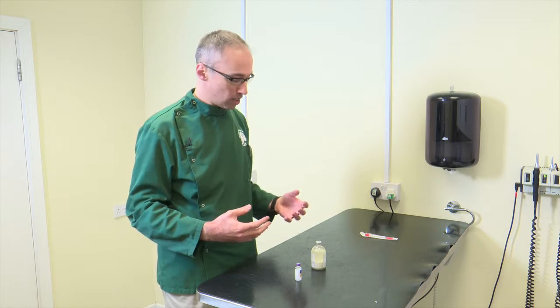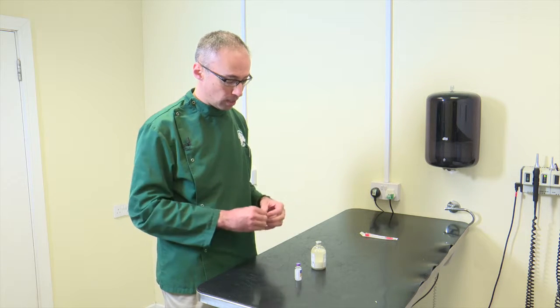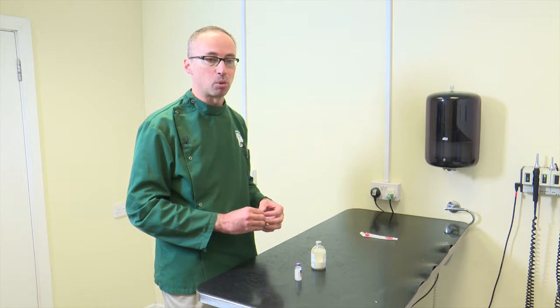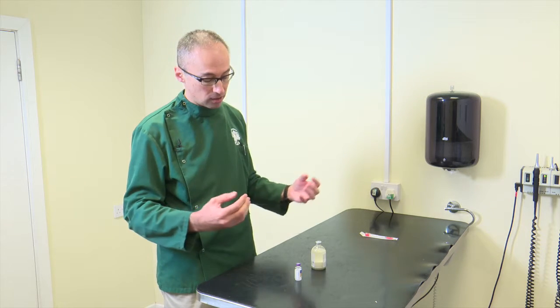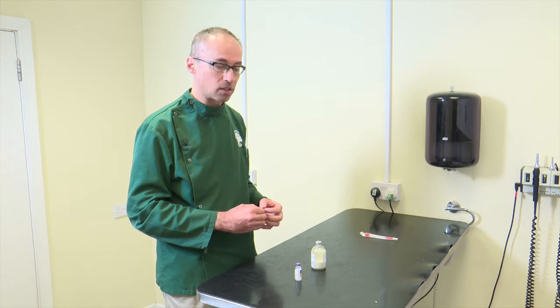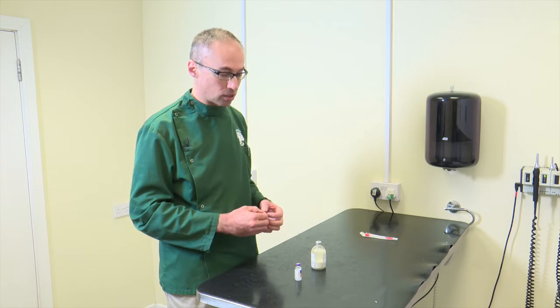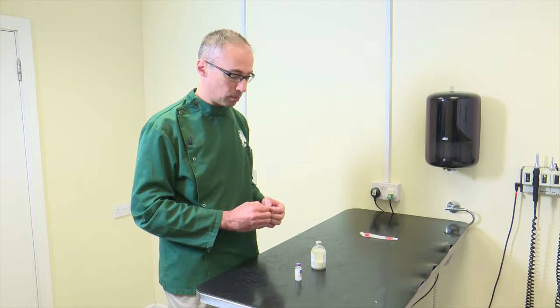We are just going to demonstrate how to draw up the insulin. Before we do that, I want to remind you that you do need to keep your insulin in the fridge. It is very important that insulin and indeed the desensitizing vaccines are kept at the correct temperature. If they get too hot they will become denatured, so it is very important that you do keep it in the fridge.